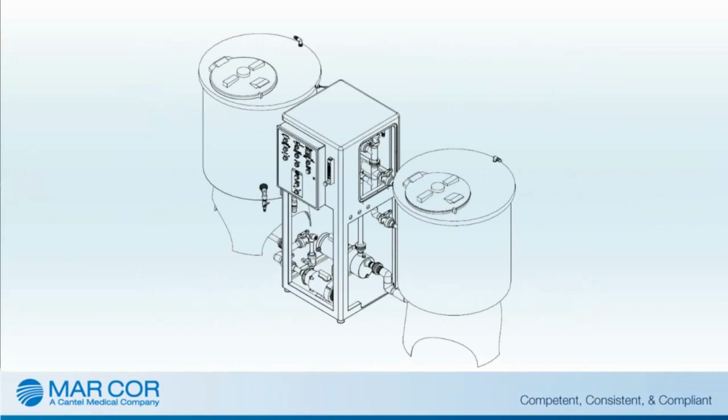The pressurized solution distribution system, referred to as the PSDS, is used in a hemodialysis facility for the mixing and distribution of sodium bicarbonate solution and the distribution of acidified concentrate solution to remote points of use where they are used in hemodialysis.